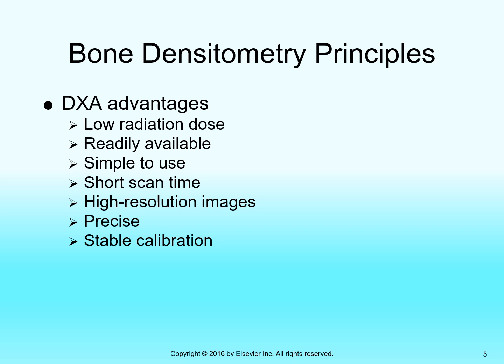What's your part thickness? The part thickness isn't changing. The energy of the X-ray beam is changing. That's the variable. The actual density or calcium content of the tissue is not changing from the first exposure to the second exposure. So the only thing that changes is the energy of the beam.